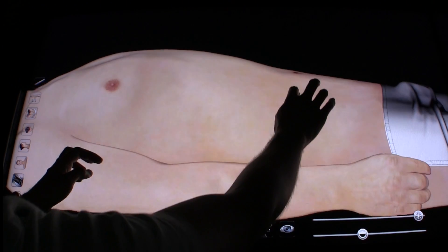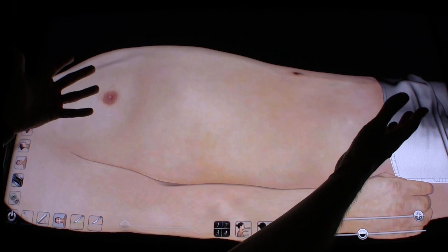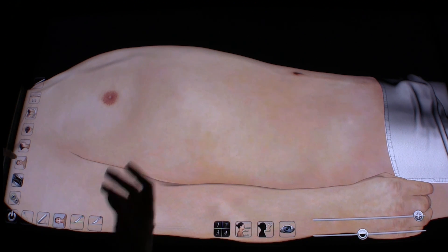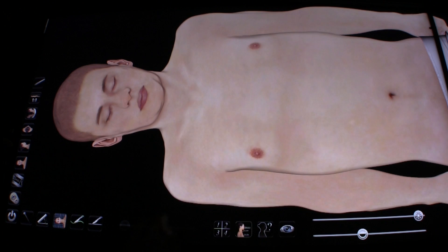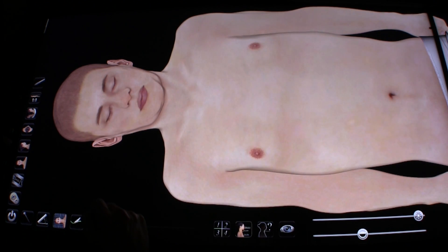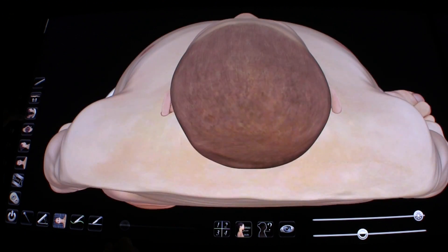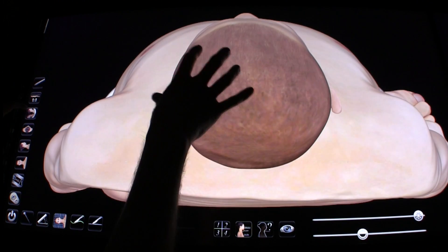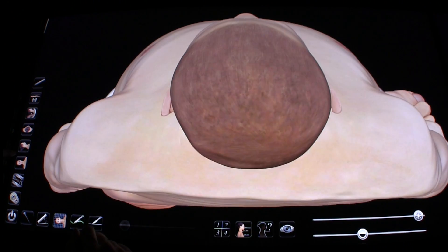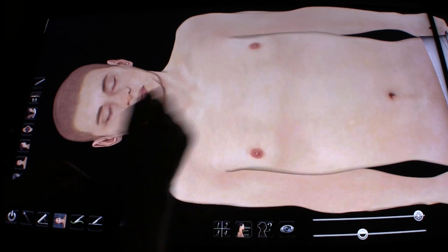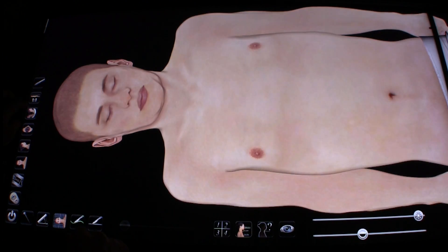Now I've zoomed in way too far, so let's say I want to bring the model back to how it was. There are some predefined views available on the left-hand side. The bottom one is the picture of the model looking up — if you tap on that, that's the same view we had at the beginning of the video. You can also change to the side, look at the top, or the top button with the arrows allows you to flip the view of the model from one side to the other. So if the model you have loaded is laying down, you can use the arrows to flip it from one side to the other.